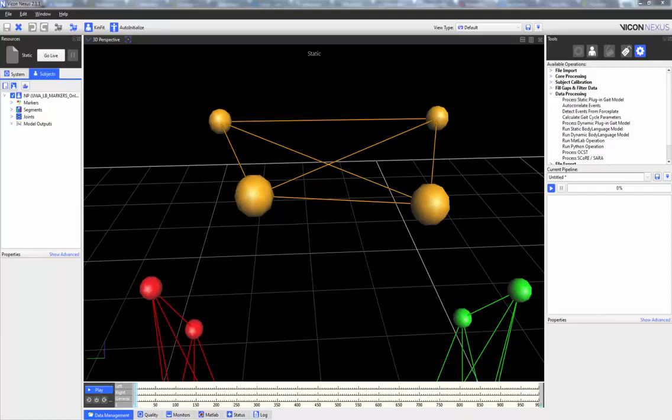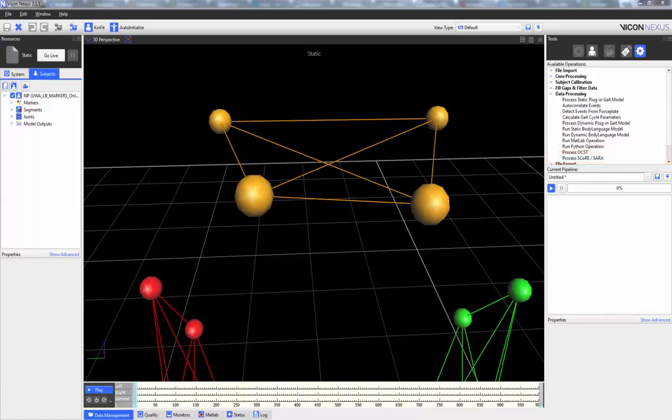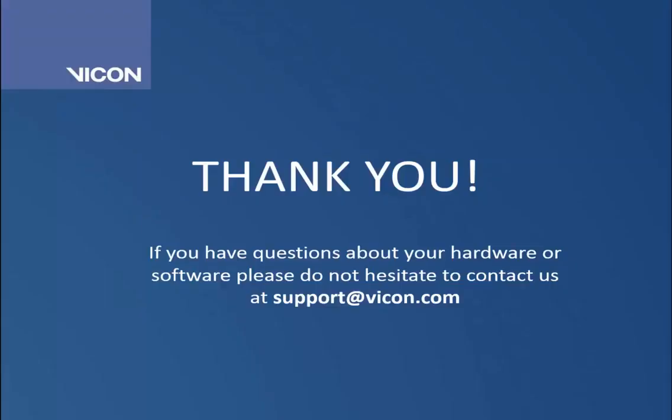For more information about the process OCST and process SCORE and SARA data processing operations, please refer to the video dedicated to calibrating and processing SCORE and SARA. Links and further information are available on the panel. Thank you.